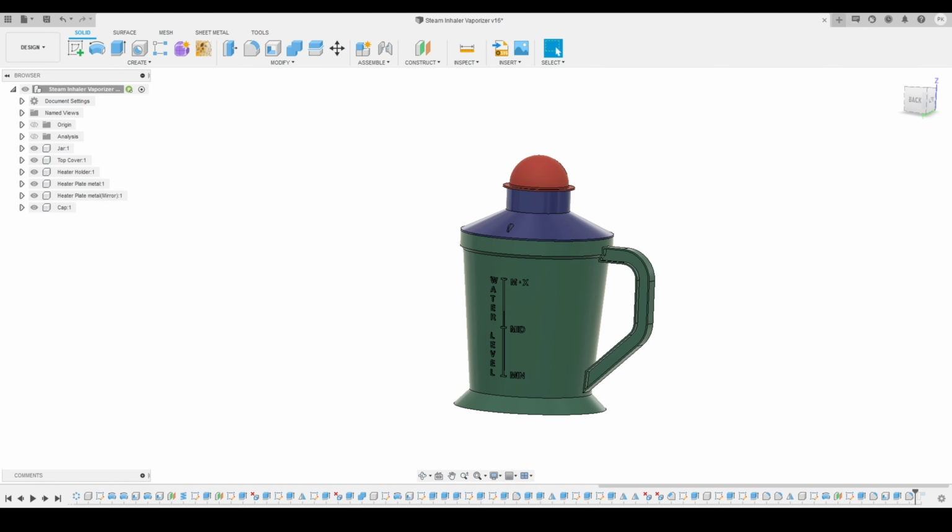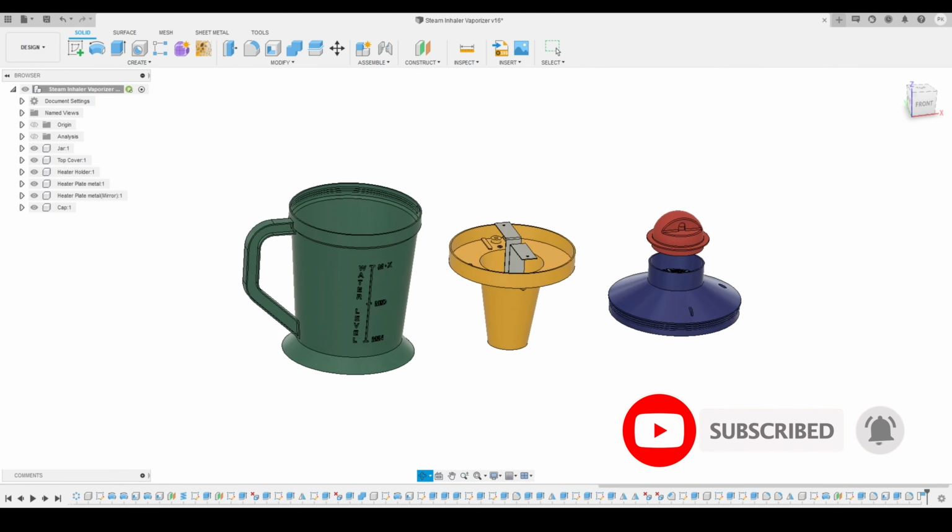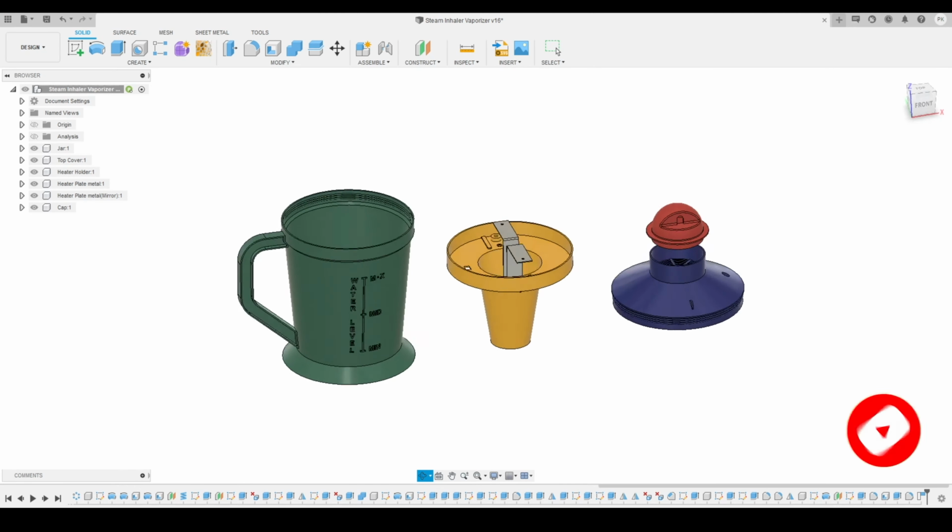I'm going to show you how we can model all the components and fit them together to make this complete workable jar. This is a reverse engineering project. I had this actual product with me. I just disassembled it and tried to do the complete modeling inside Fusion 360, and I am making this tutorial for you.